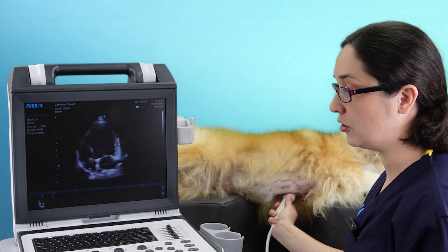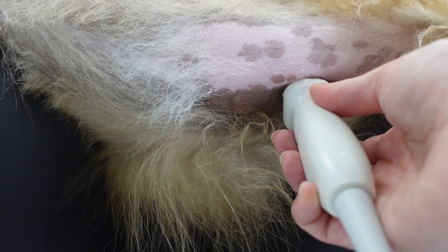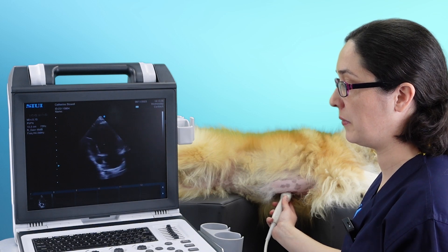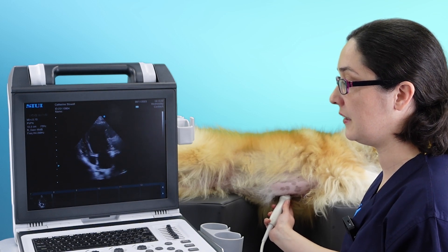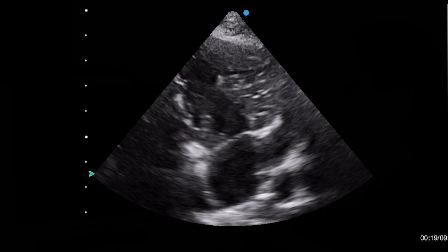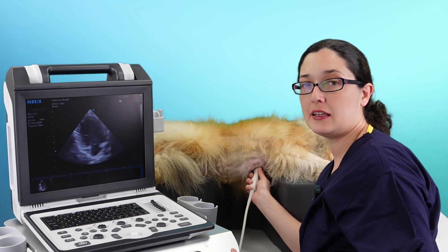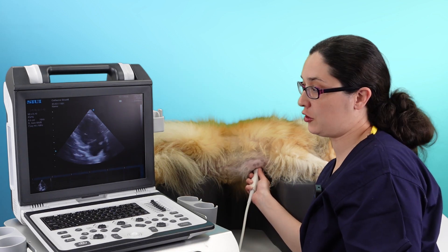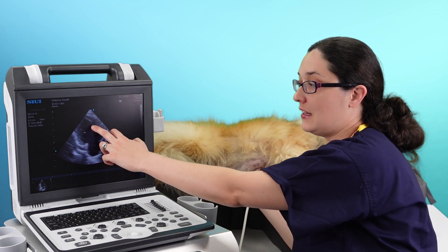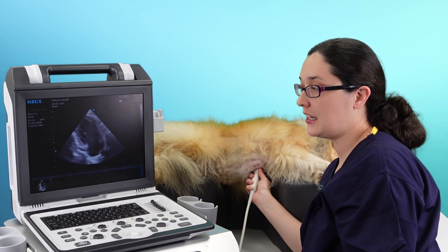Once you're happy with your four chamber view, you're now going to twist anti-clockwise to get a two chamber view. As I twist, the right ventricle is disappearing from my image, and I want to keep going until it's gone completely from my picture. You want to get your left ventricle and left atrium as vertically down your monitor as possible. It's the two chamber view, so you just need the two chambers: left ventricle, left atrium.